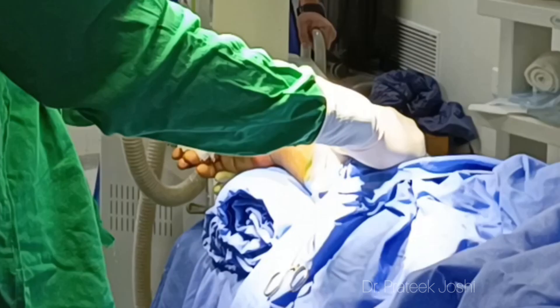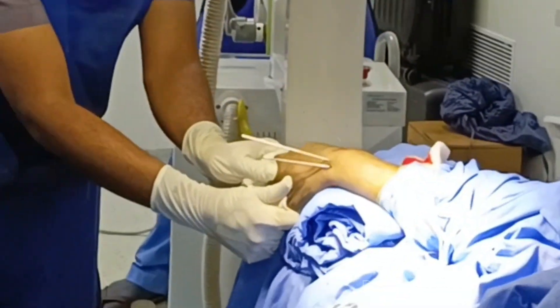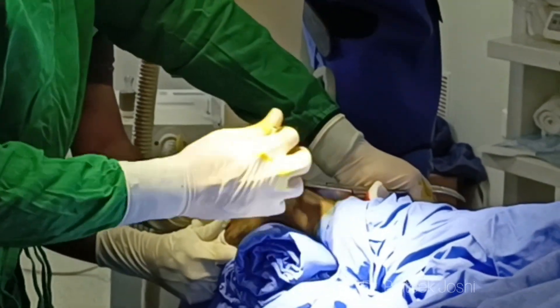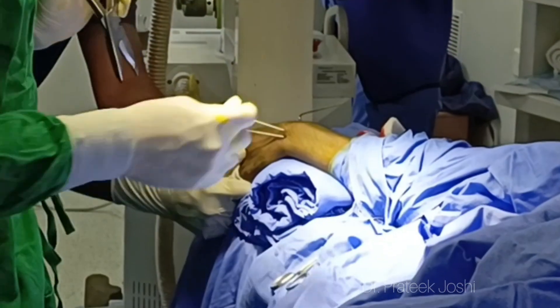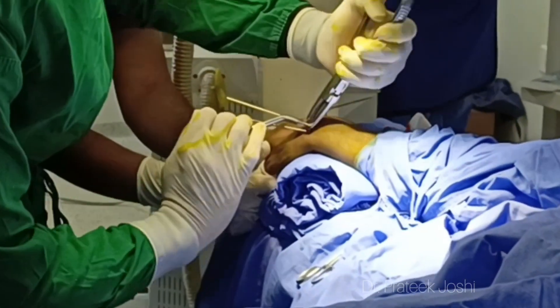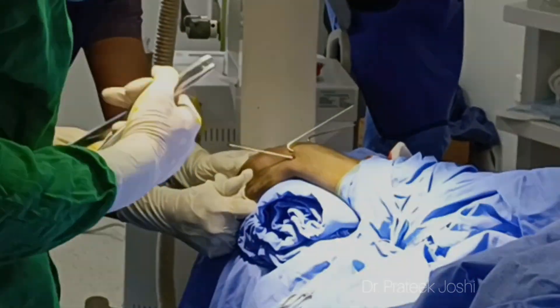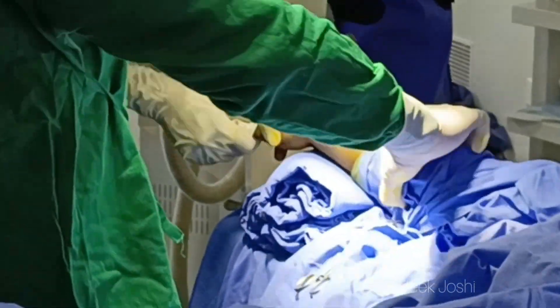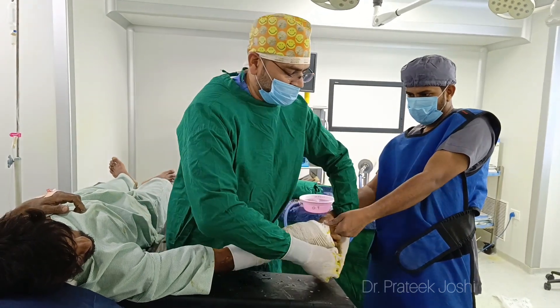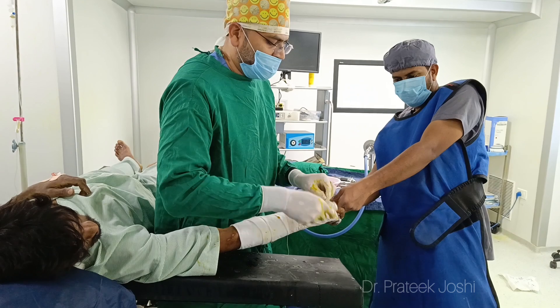We are done with the third K-wire insertion. The reduction is quite good based on the IITV images and we are going to accept this reduction. Now I am going to bend the wires — bending is important because we don't want the wires to migrate further inside. The bent tip of the K-wires will keep them in position. We are now done with the K-wiring procedure and going to apply a below-elbow cast. Before applying plaster we have done pin-track dressing with betadine-soaked gauze.